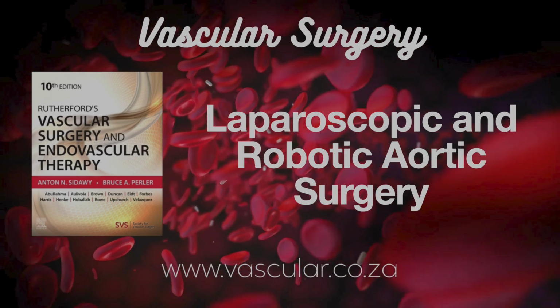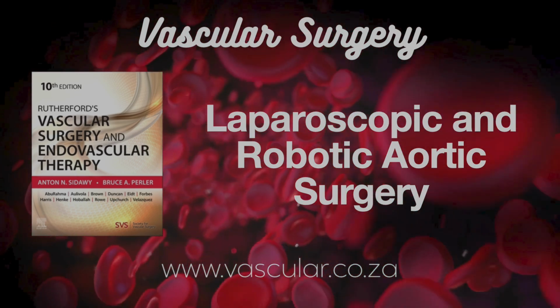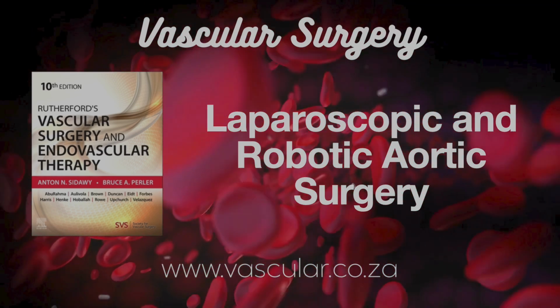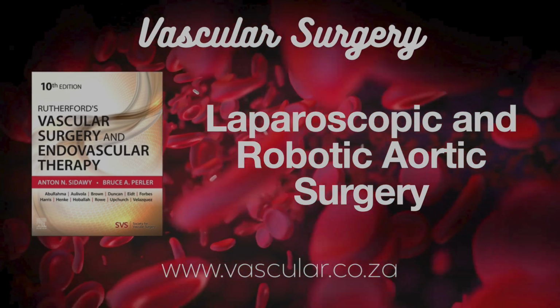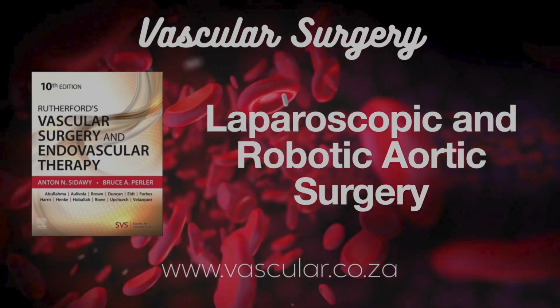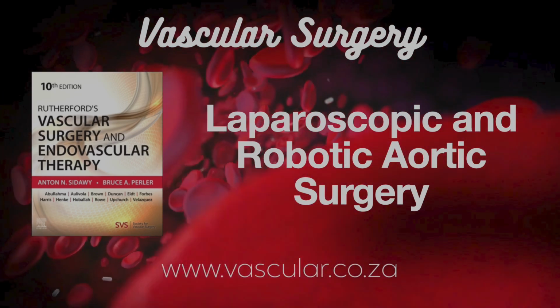First up, total laparoscopic aortic surgery, TLAS. What are we actually talking about here? So TLAS means doing the whole aortic repair using just small keyhole incisions, with special long instruments and a camera. All through tiny holes, basically. Pretty much. And the textbook breaks it down into 4 main ways surgeons can get access. 4 approaches. 4 ways. Yeah.